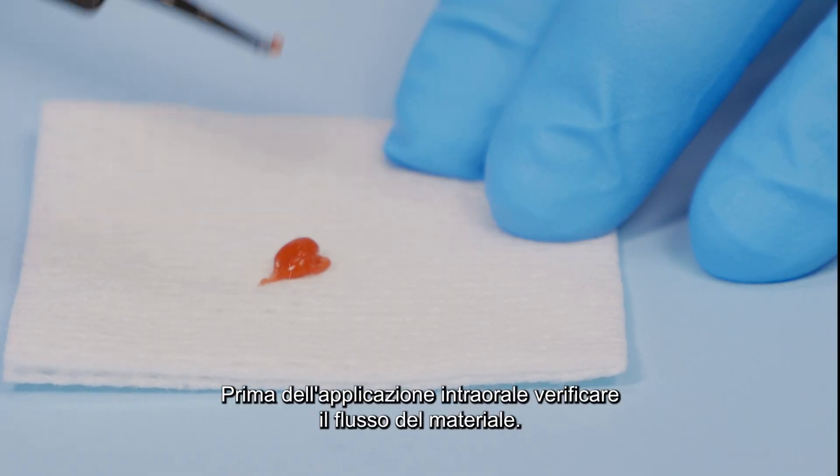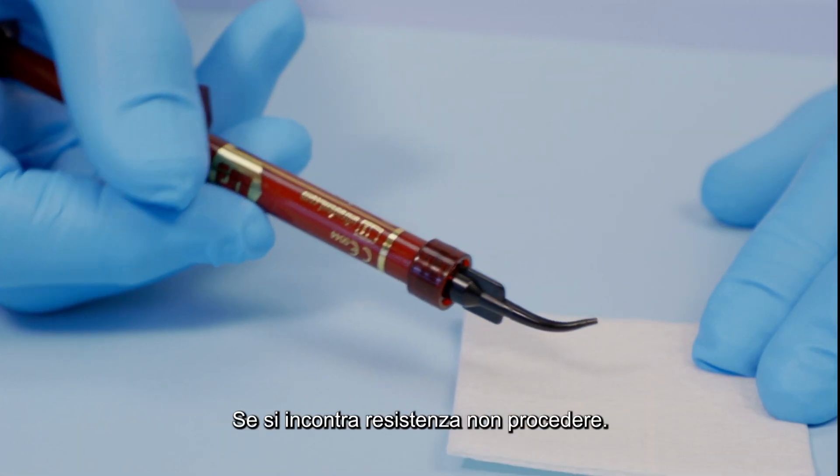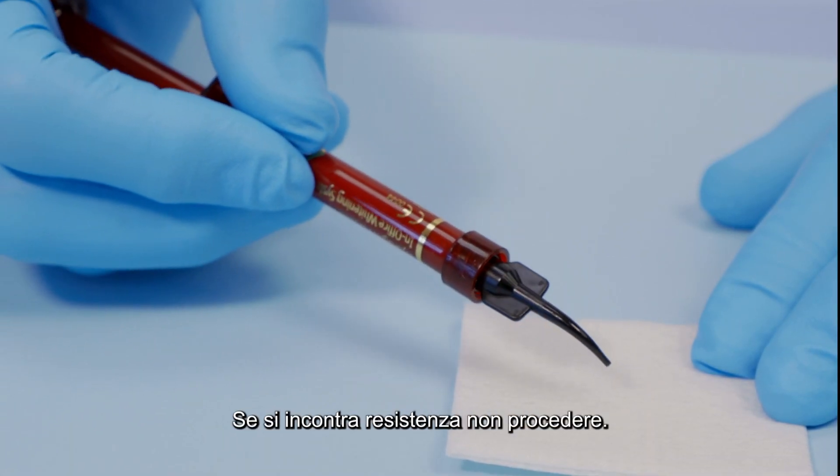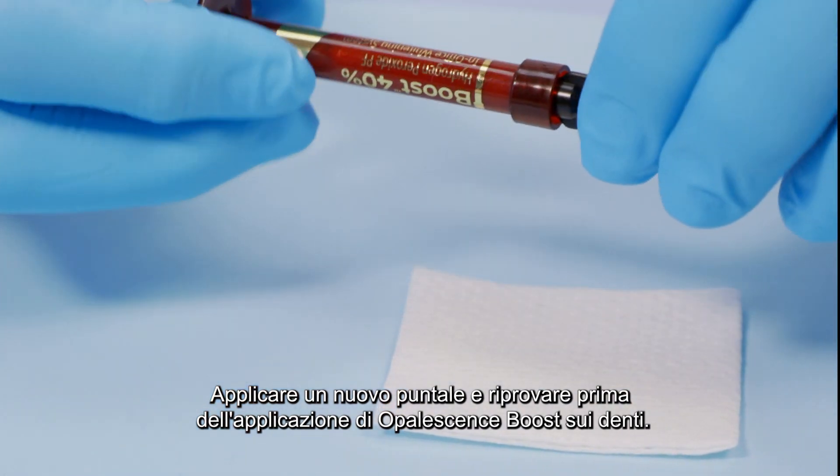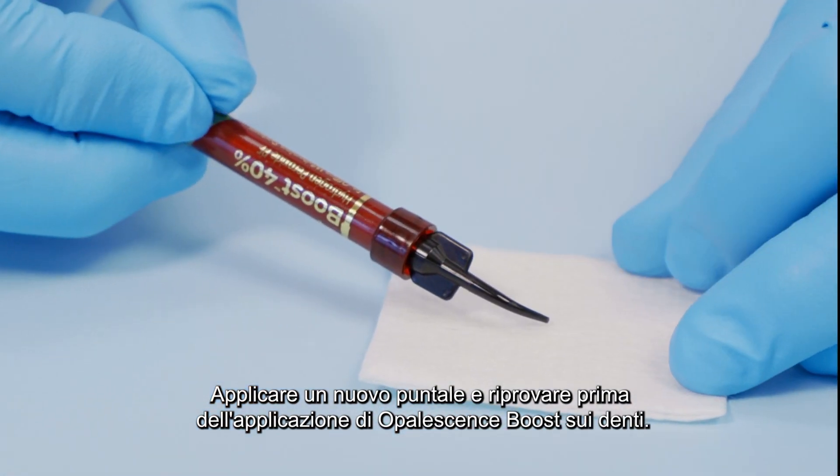Verify flow prior to applying intraorally. If you feel any resistance, do not proceed. Attach a new tip and test the flow again before applying Opalescence Boost whitening gel to the teeth.